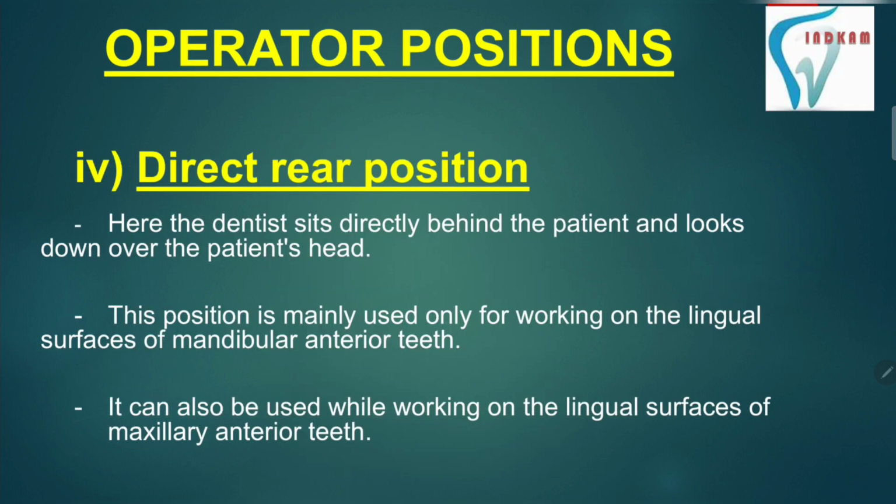The next position is direct rear position. It is extreme rear, that is almost 90 degrees. Here the dentist sits directly behind the patient and looks down over the patient's head. This position is mainly used only for working on lingual surfaces of mandibular anterior teeth, and it can also be used while working on the lingual surfaces of maxillary anterior teeth.